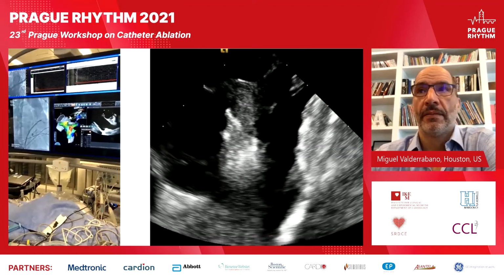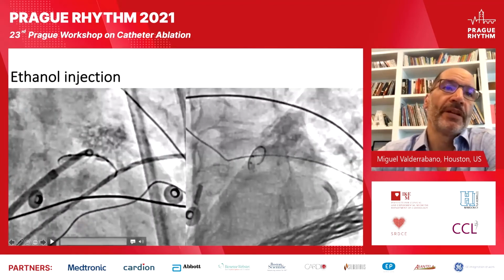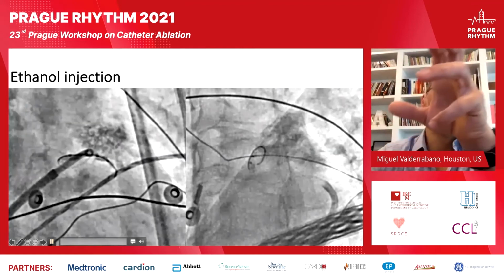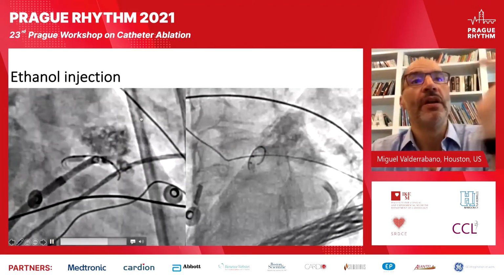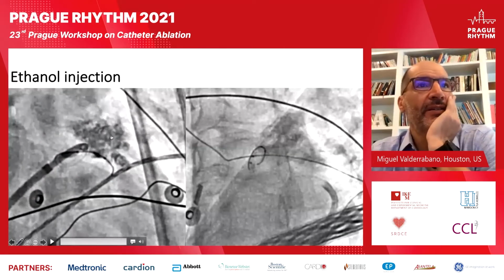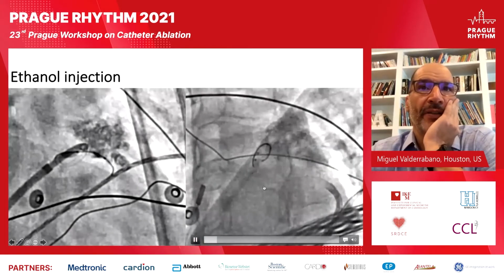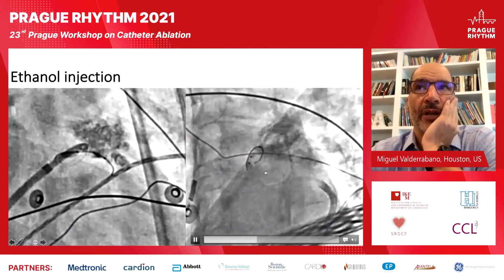All right, the two balloons. It's very common after several injections that the alcohol gets extravasated and you see more staining than you would want. This kind of staining is outside the myocardium. This is probably epicardial fat where contrast has leaked. We know the therapeutic effect is concentrated between the two balloons.